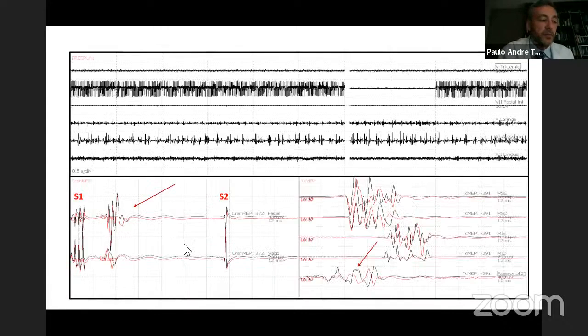And here we can see the A train up here, and the corticobulbar map, and the facial and vagus nerve. Facial here and the vagus nerve here, A train, and the pulse. At that time, I was using train and pulse, before I changed to the pulse and train.